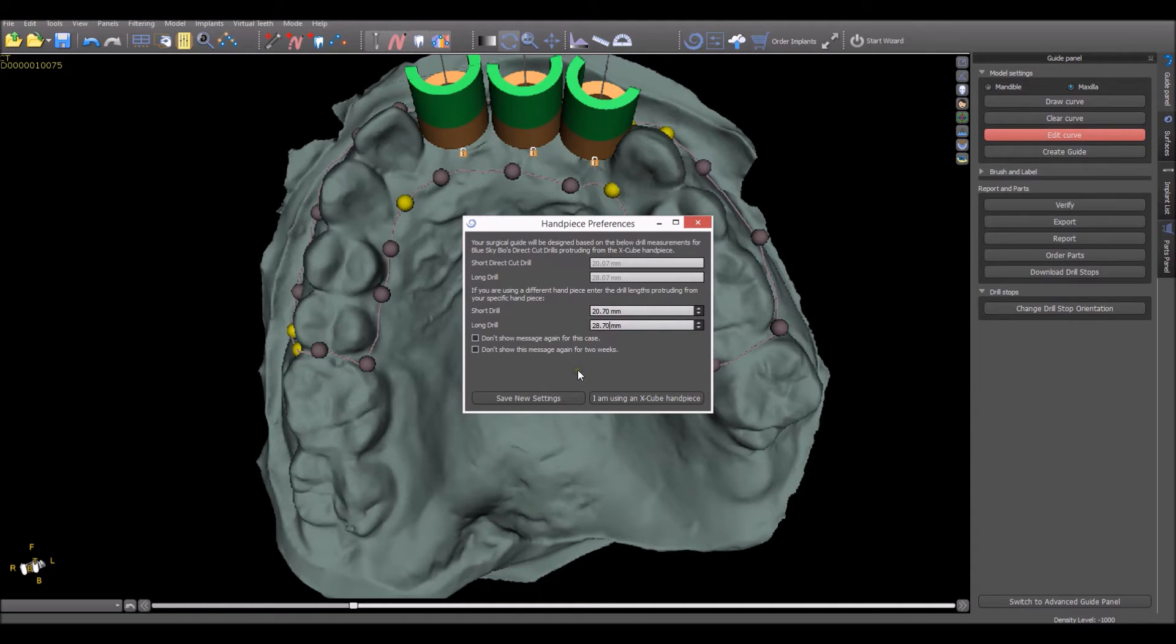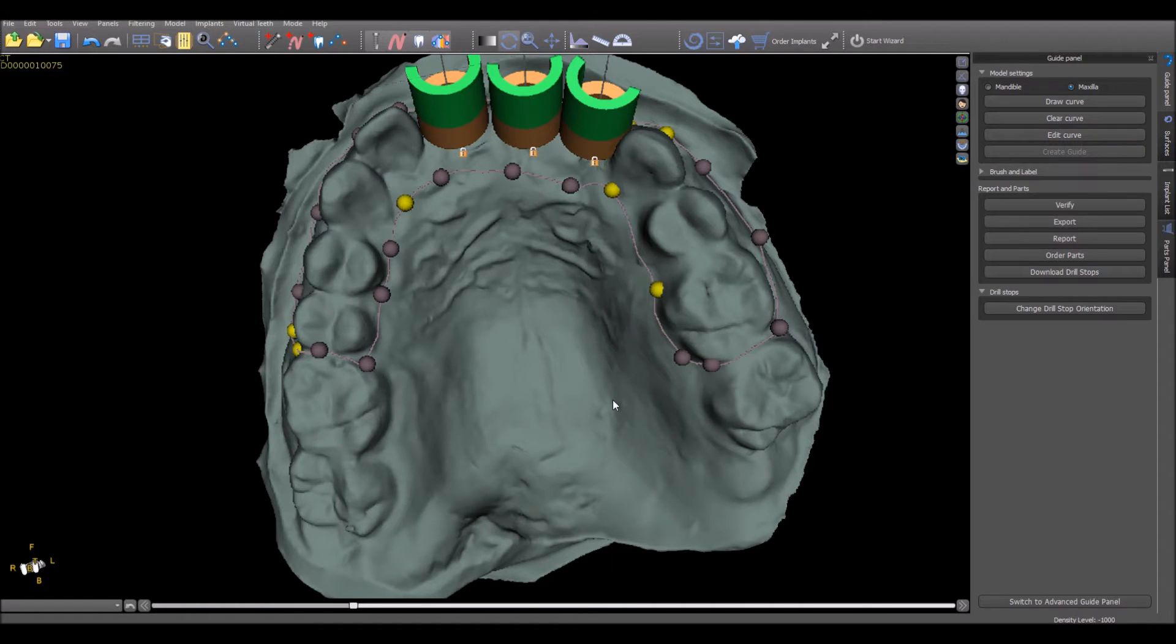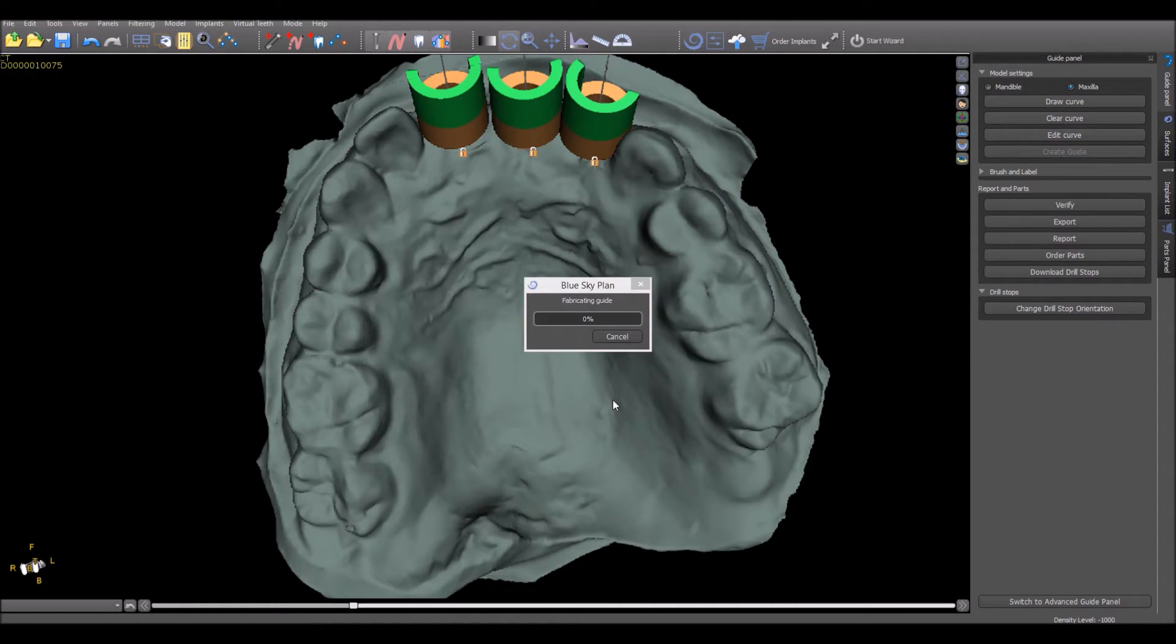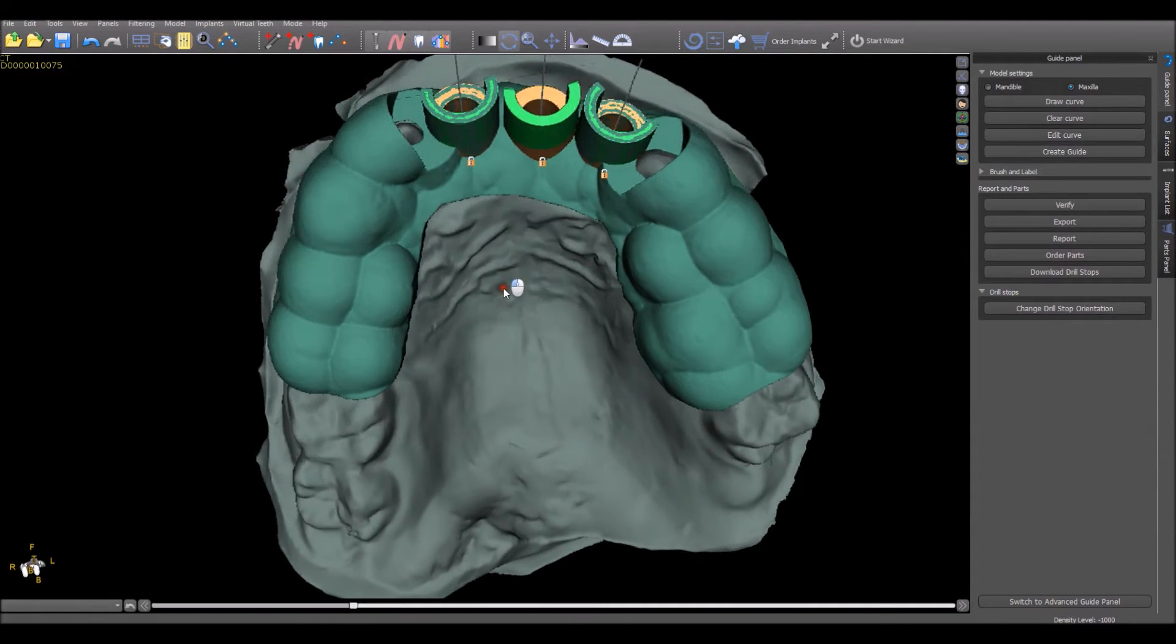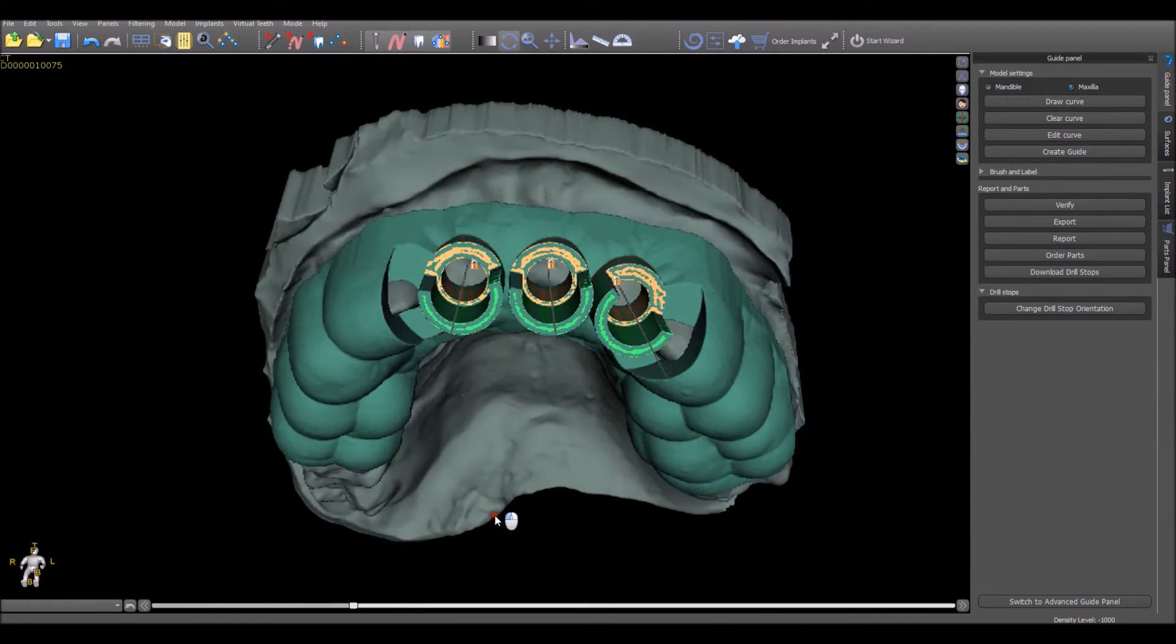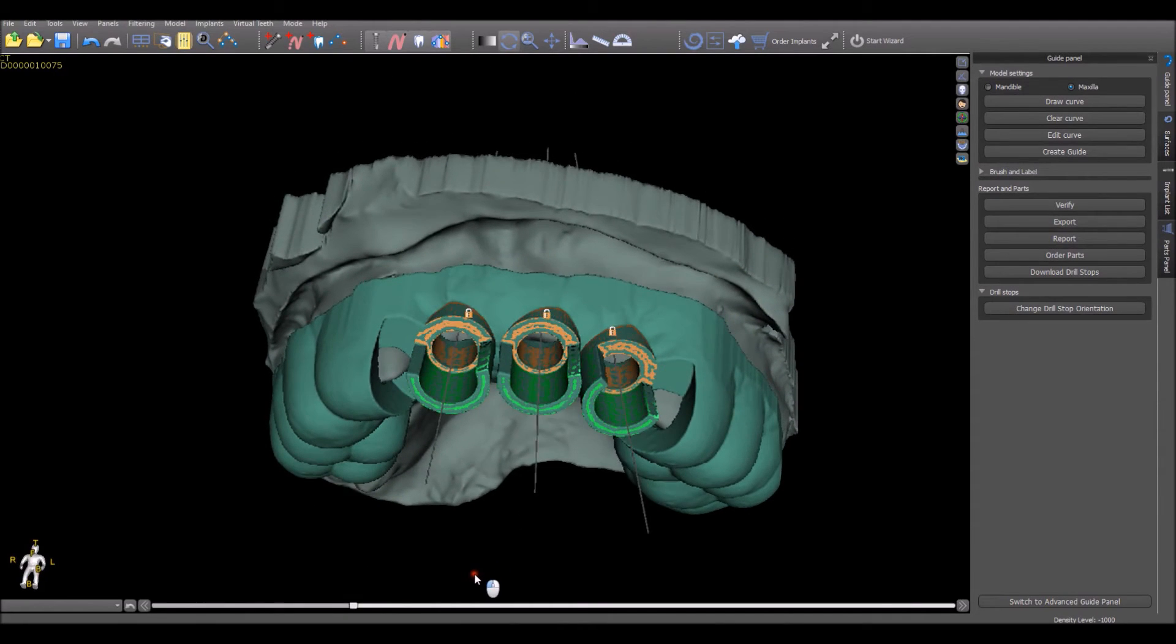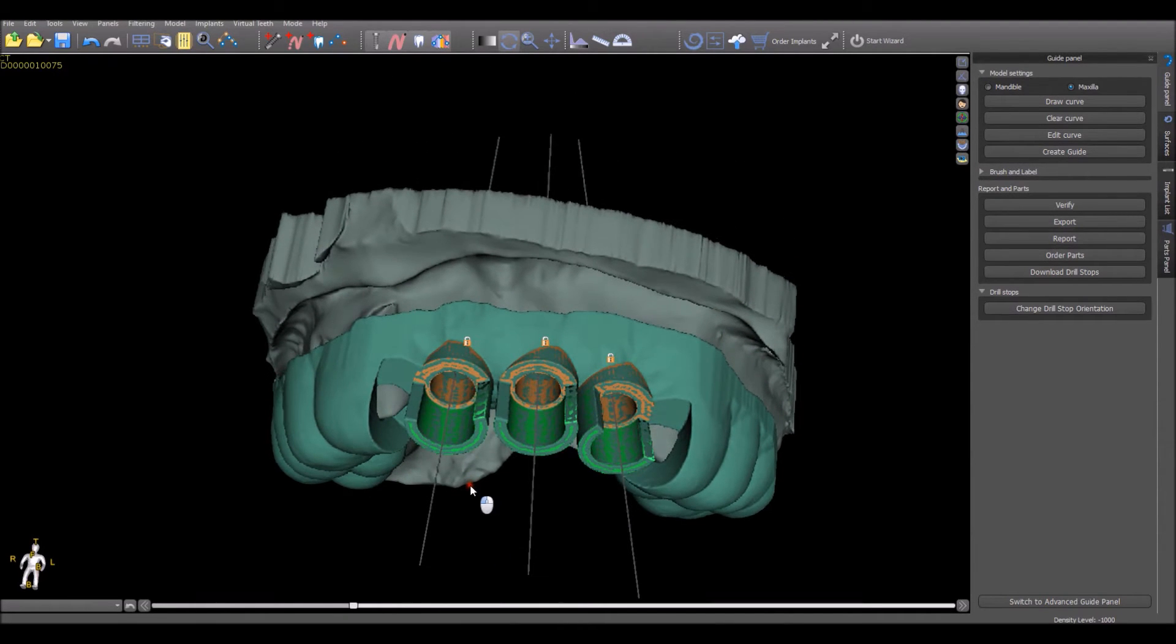If you are using the X-Cube handpiece, simply click I Am Using X-Cube Handpiece. The software will now fabricate the surgical guide based on the settings that you have entered. As we can see, the fabricated surgical guide includes the printed built-in drill stop.